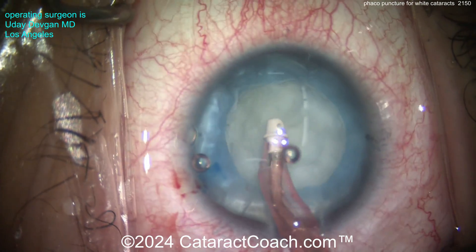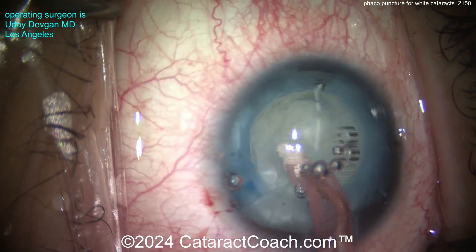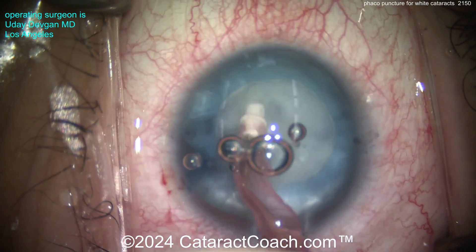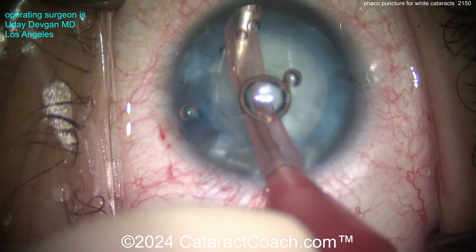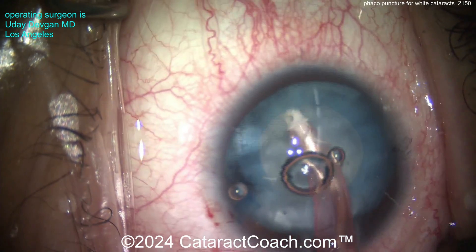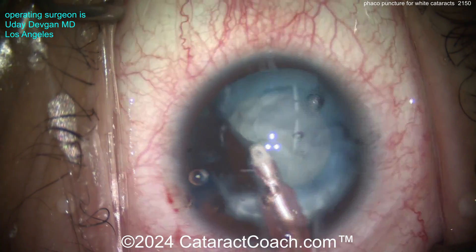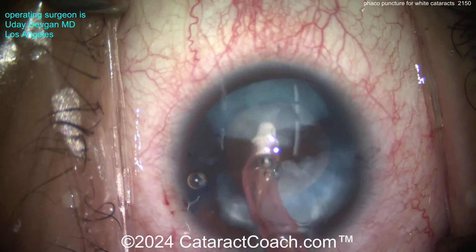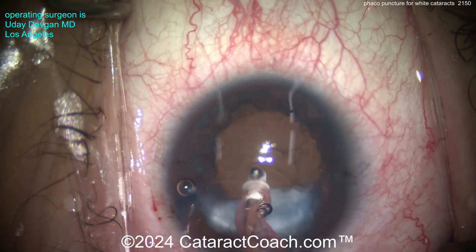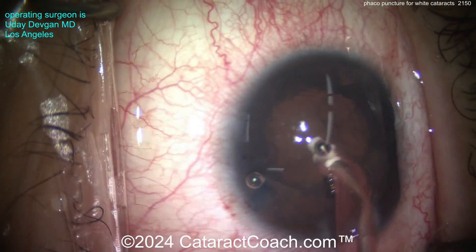The hardest part of this case, of course, is getting that anterior capsule rhexis made. Now I can just aspirate all the pieces of lens material out — it comes out pretty easily. There's really no nuclear sclerosis. The patient is also myopic, so I lifted up the iris to reduce retropulsion — that's LIDRS, lens iris diaphragm retropulsion syndrome, as described by Osher and others.